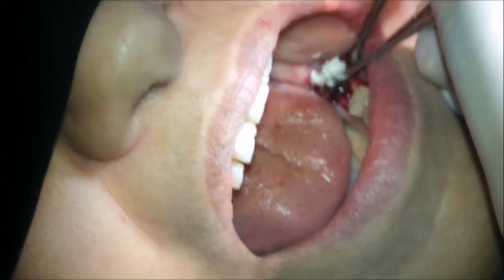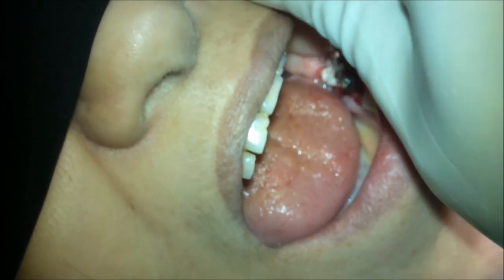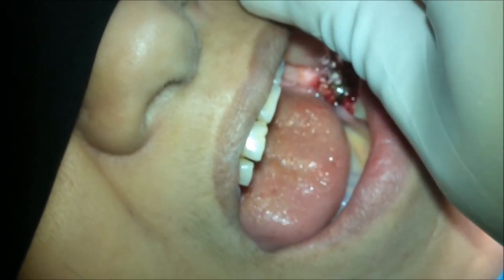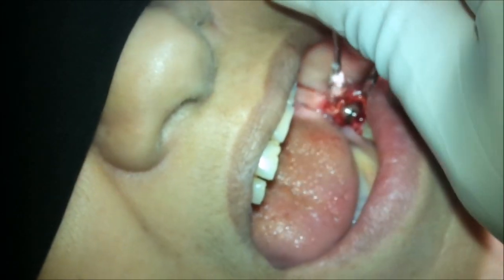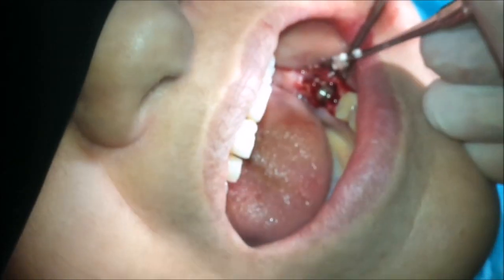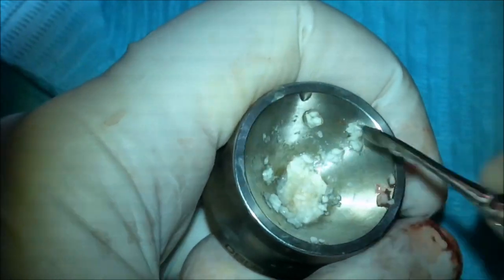I usually put the cover screw to avoid the entrance of the bone graft particles inside the implant. So I always prefer to put it first. Then after packing the bone graft, we remove it and fix the membrane.